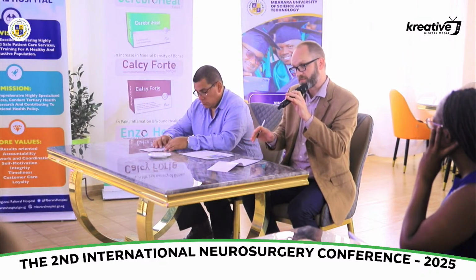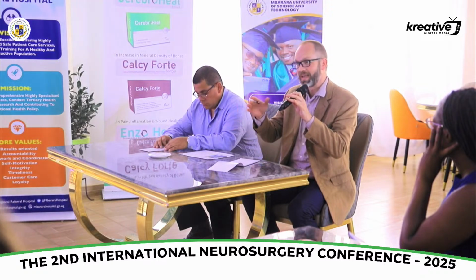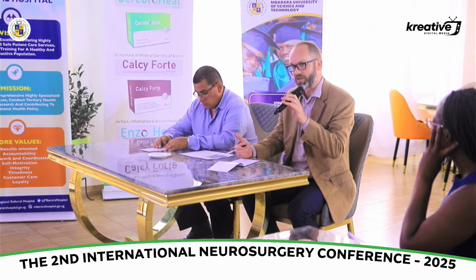And more important is learn B mode. Be comfortable with B mode for basic things. Then get into vascular imaging. And then the vascular imaging can be very useful also at the bedside in the ICU or the HDU to help follow these patients.